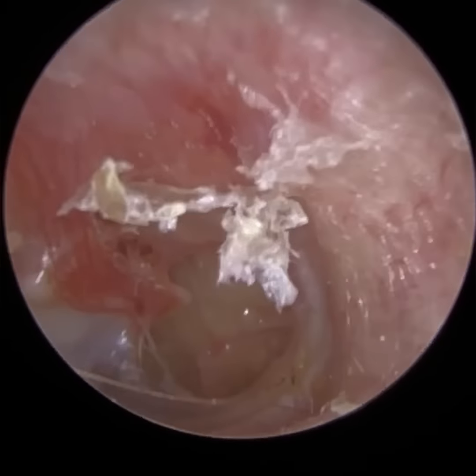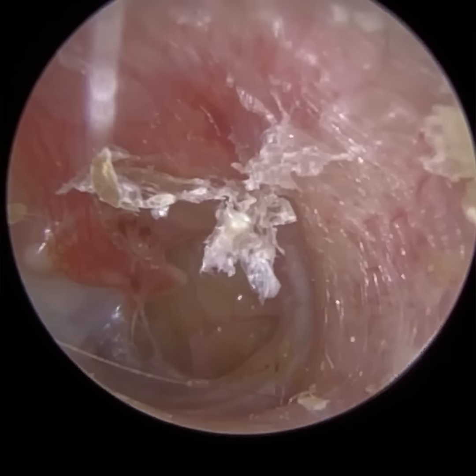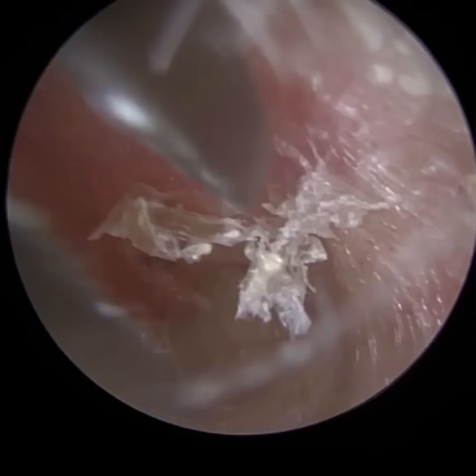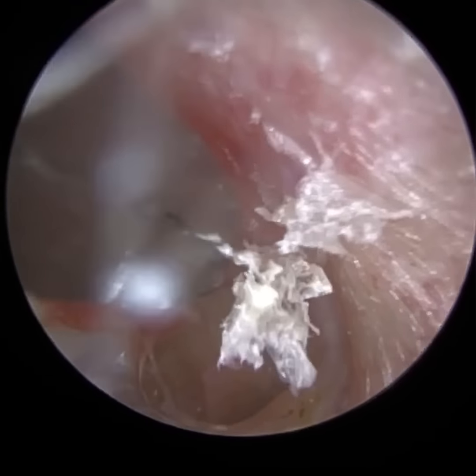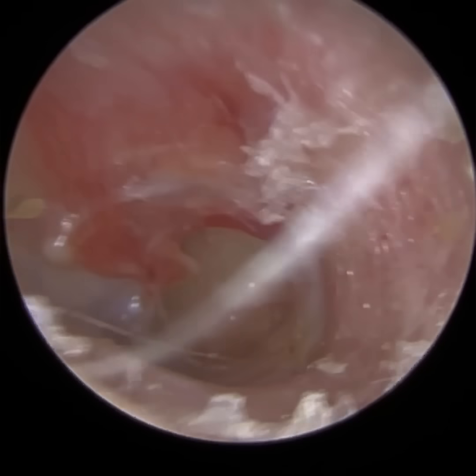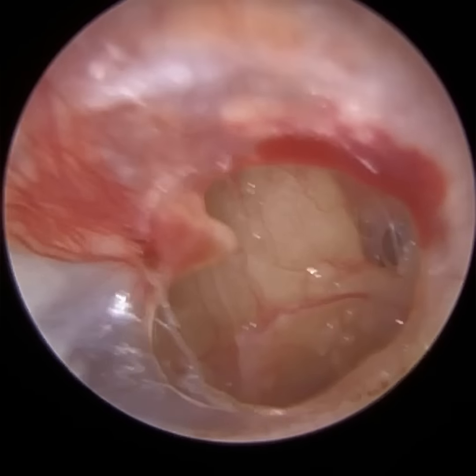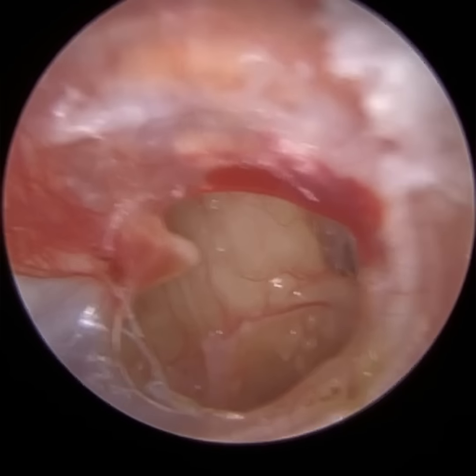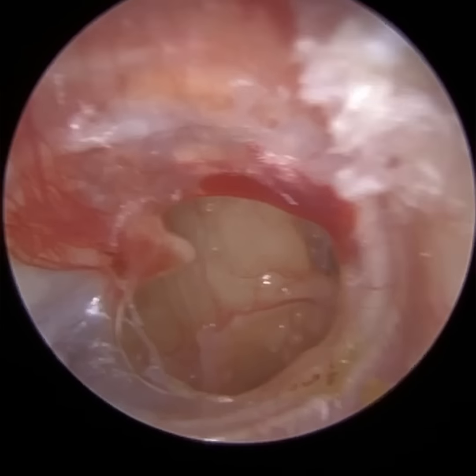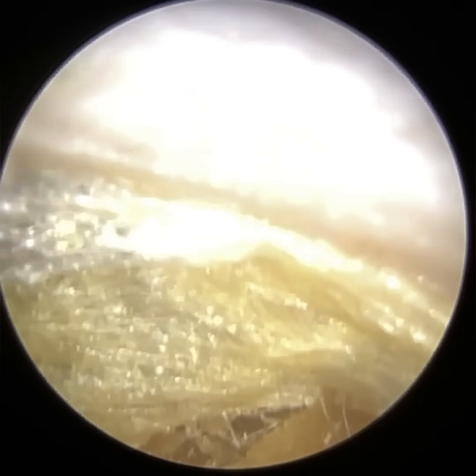So there's a condition called otosclerosis. Otosclerosis is when you've got this spongy bony growth that develops on the stapes bone that connects to the oval window. And when you get this spongy bony growth, you can see it just got a bit red there, but we managed to clear that. And instantly the patient felt they could hear better, and they weren't experiencing any itchiness or irritation. So I'm really pleased with that. So just going to move on to the right side.